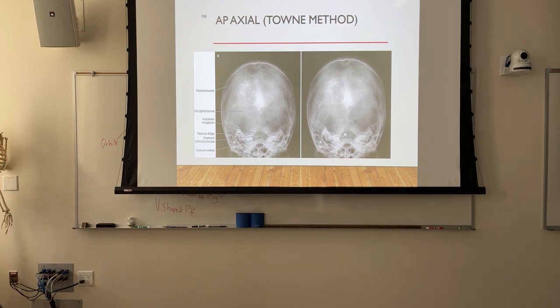So in this case, again, I think we might be looking at a skull phantom. I don't know that for certain, but the posterior clinoid processes should be inside the foramen magnum on the Towns. But once you increase your angulation all the way up to 40, even 60 degrees, and this is assuming that you've got your orbitomeatal line perpendicular, then even the foramen magnum appears more elongated, and those posterior clinoid processes just project out.